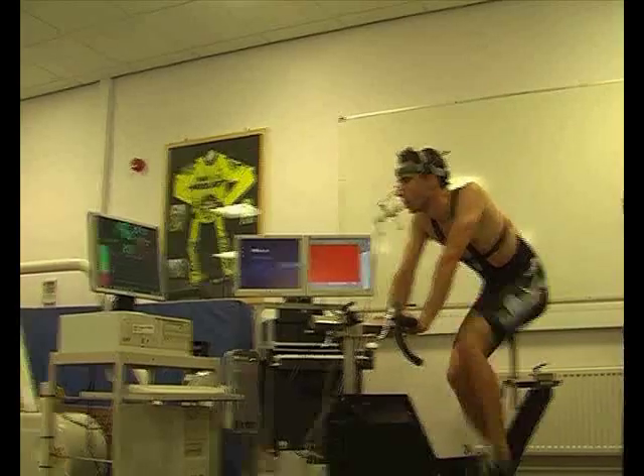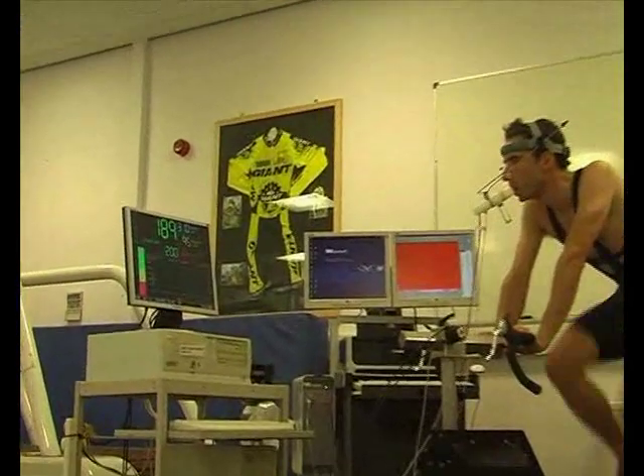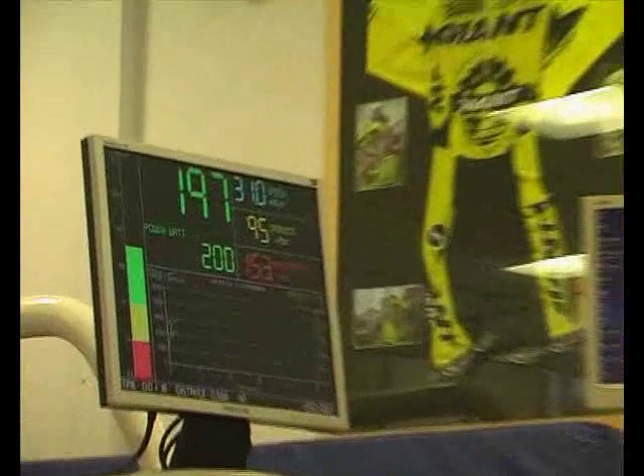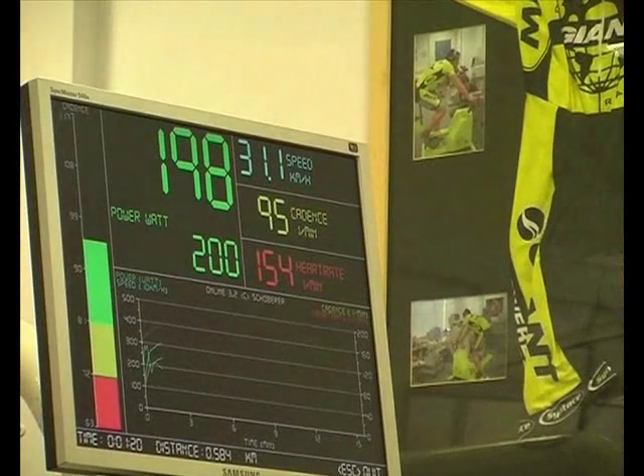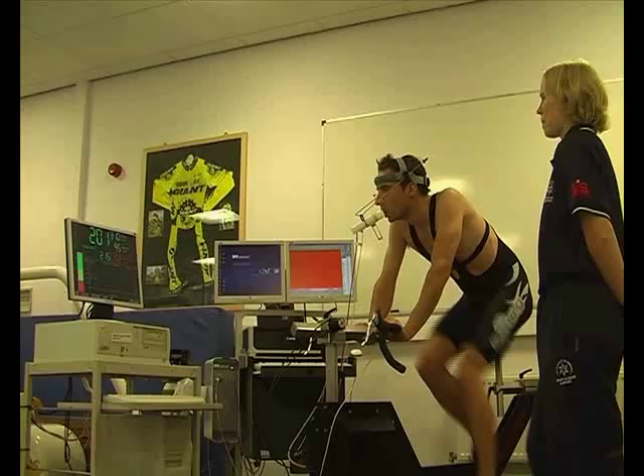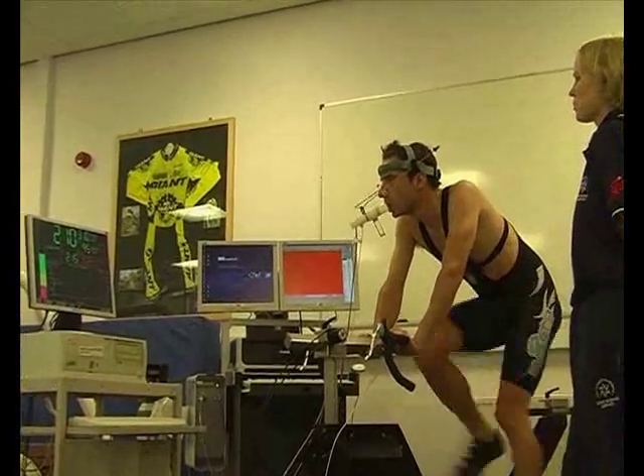During the protocol, all the athlete has to worry about is keeping his cadence steady — the computer does the rest. Here is the SRM screen: the top figure, 197, is the actual power; below that is the target power. We've also got the cadence and the heart rate.